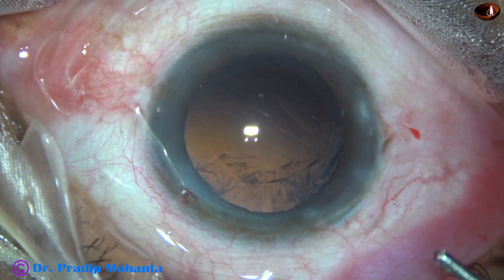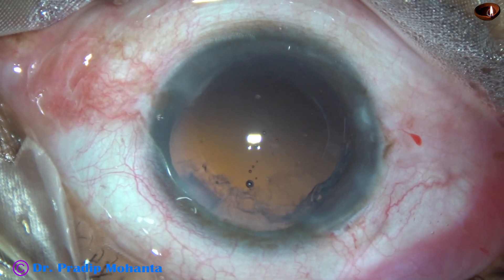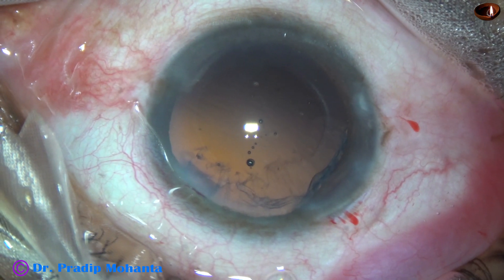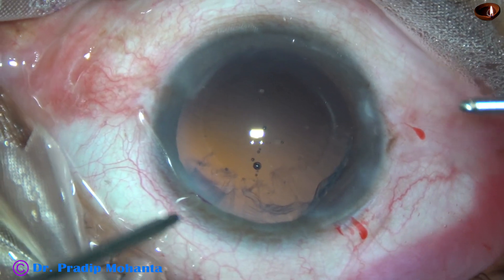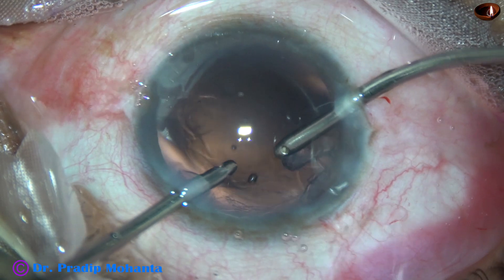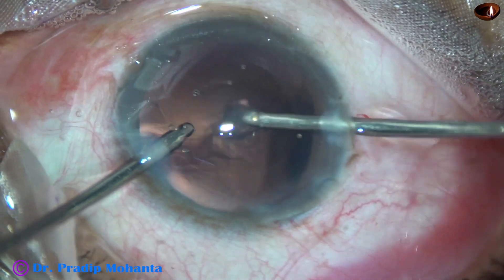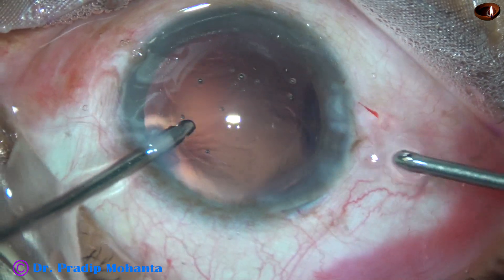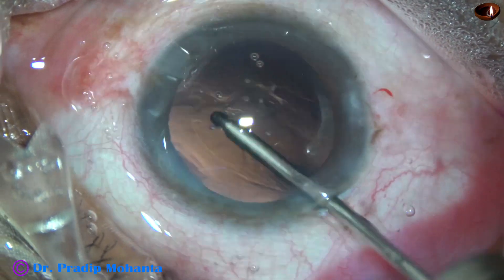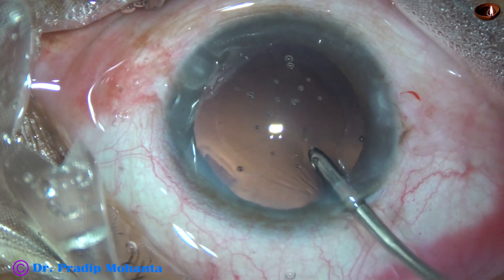We have two side ports, so we can use bimanual irrigation-aspiration. Here I am going to introduce the irrigating cannula through the left side port and the aspirating cannula through the right side port. And now the cortex is removed — vacuum is 300, flow rate is 30, and all the cortex from the upper part is removed. The lower part cortex came out along with the nucleus. This is a bit of polishing of the posterior capsule by the irrigating cannula itself.